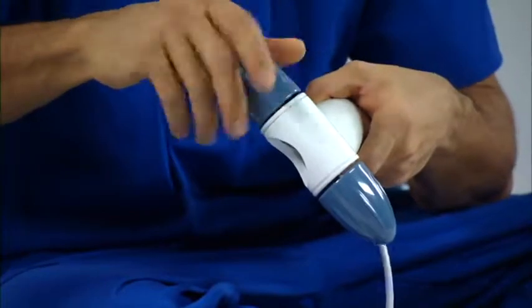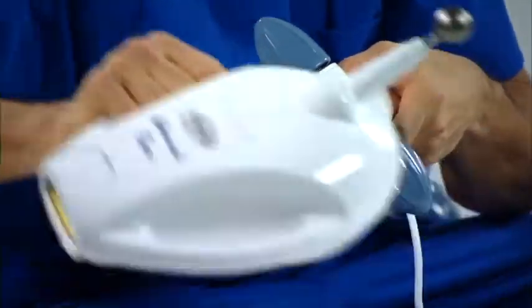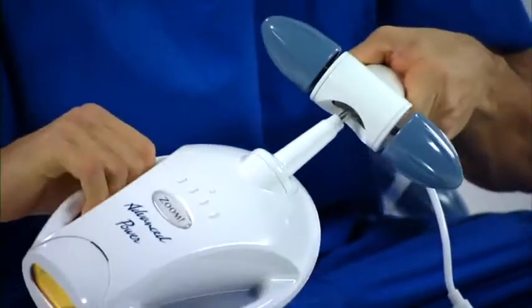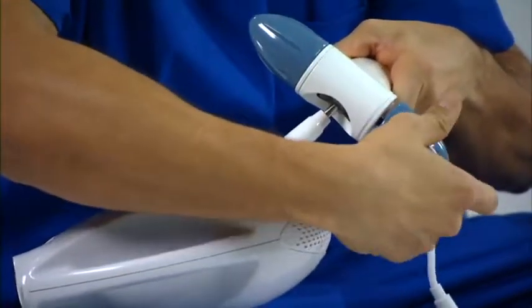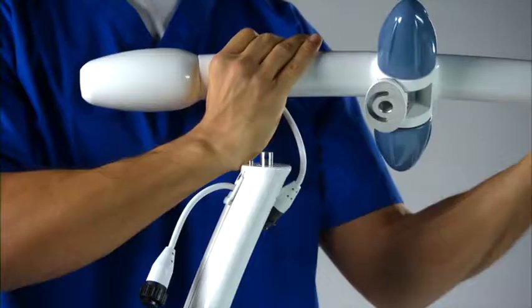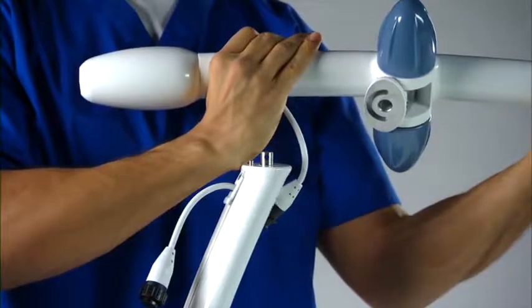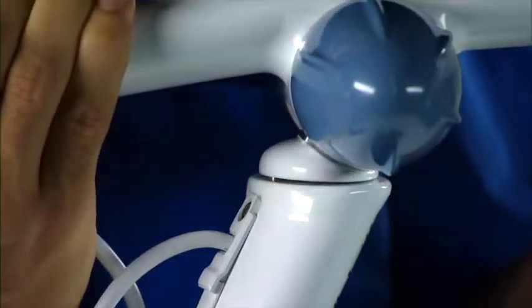To attach the lamp head, loosen the knobs by the socket at the end of the boom. Carefully but firmly push the lamp head into the socket and tighten the knobs to secure. Place the lamp boom onto the lamp stand by aligning the hole at the base of the boom joint with the stand joint.